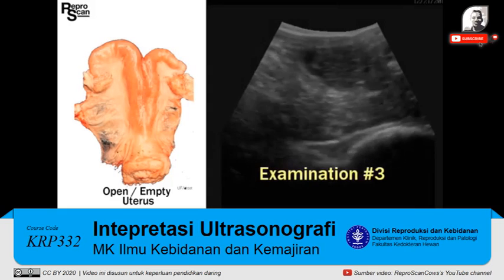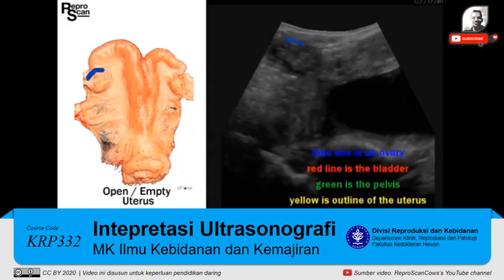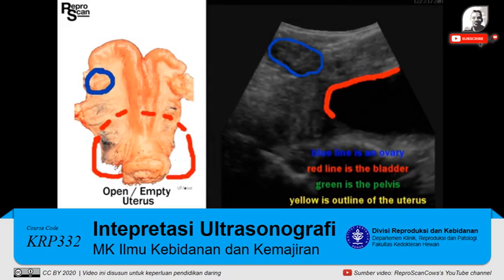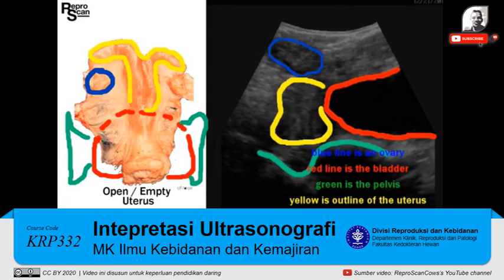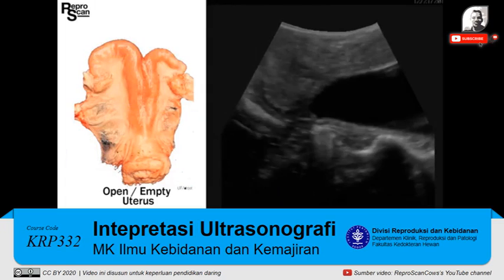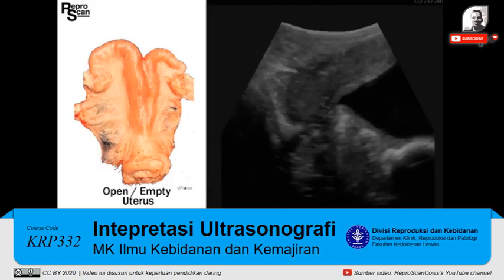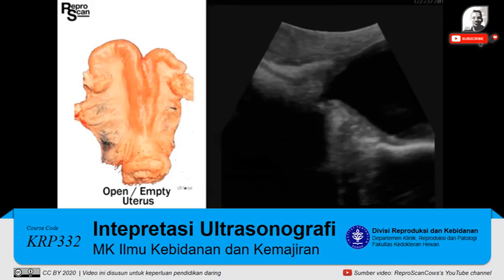Just think of that ultrasound probe rotating over that reproductive tract on the left. Here we are circling the ovary in blue, outlining the bladder and circling it on the right image, same with the pelvis, and now circling the uterus. Again, the exercise is to train one's eye to quickly identify that slightly different color of gray. There's a cross-section at the top, with a slice through the body of the uterus.